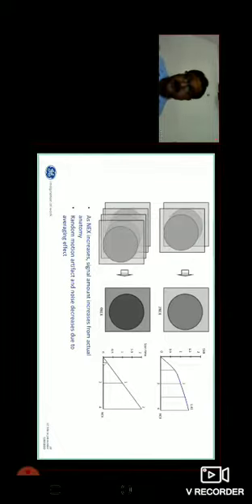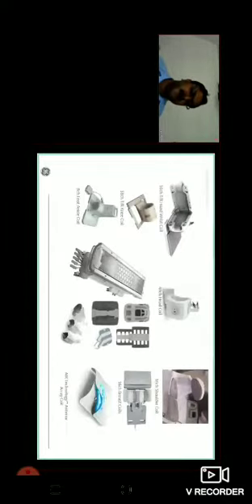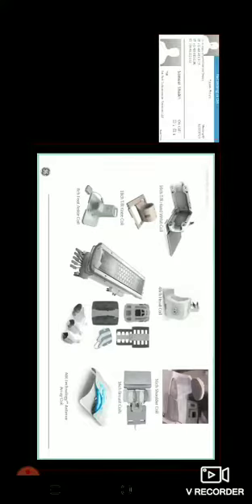Some doctors will refer for imaging of the pelvis or any other region, and some technologists, in my experience, use the body coil instead of a phased array coil, or the same coil for imaging the pelvis or other anatomical regions. That means if you are not using the proper coil, you won't get better SNR. Keep in mind to always use the proper coil for the proper anatomy.